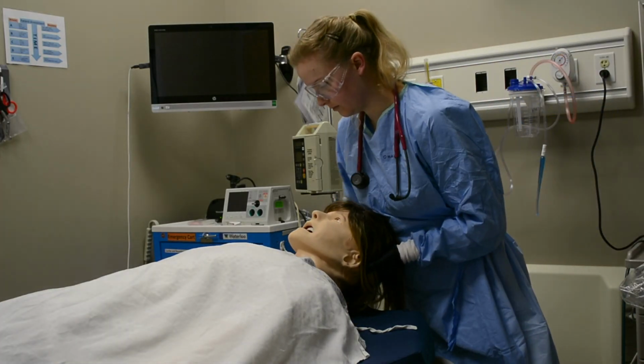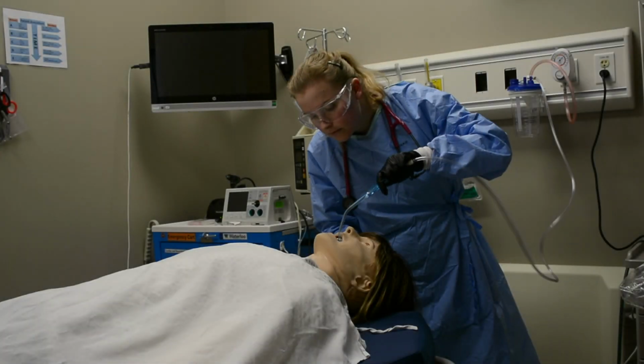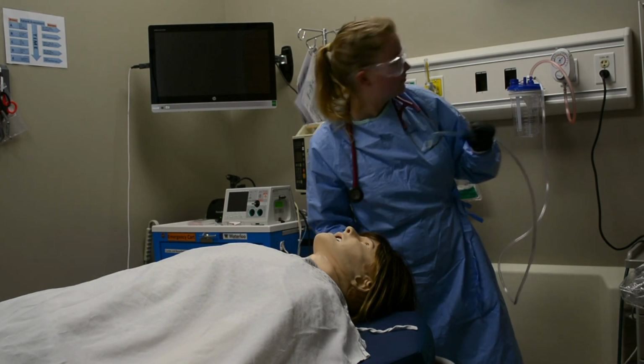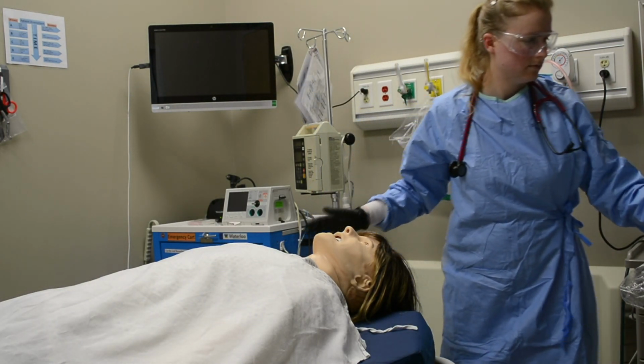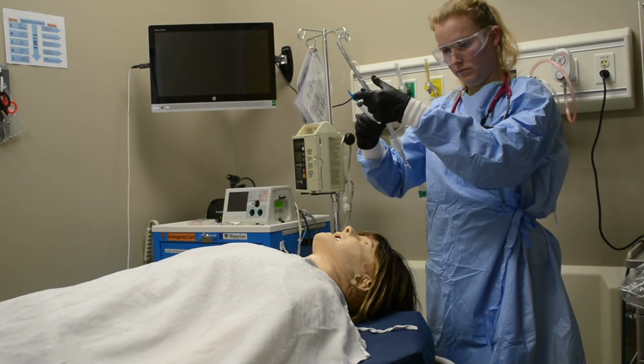Elevate head and extend neck into sniffing position. Suction mouth, removing extra secretions. Inflate the cuff on the endotracheal tube to ensure that it is not compromised.